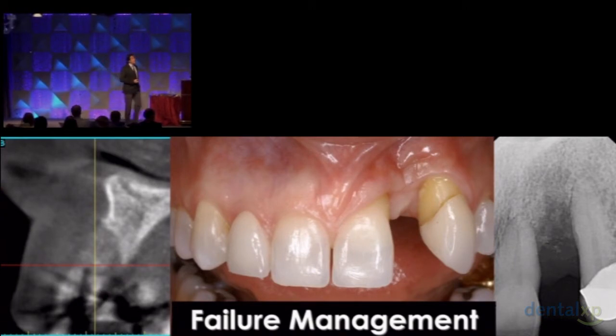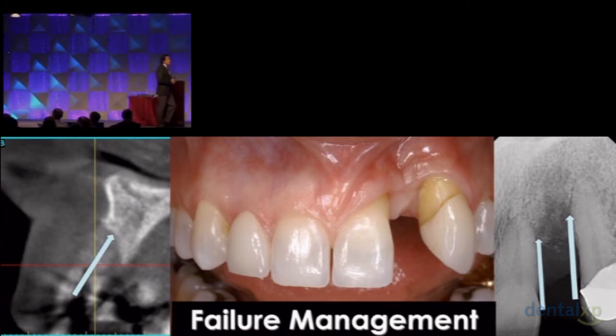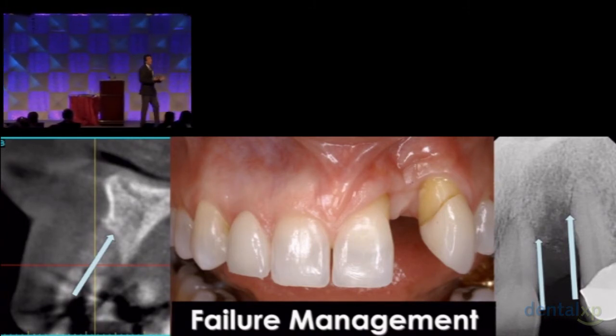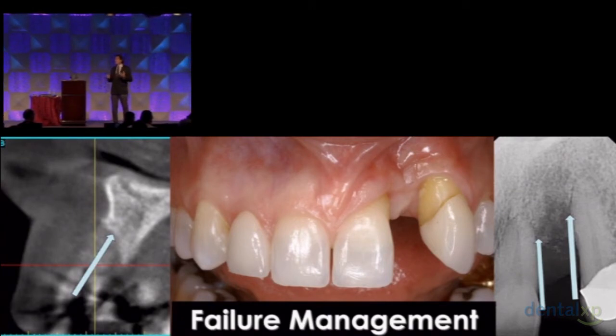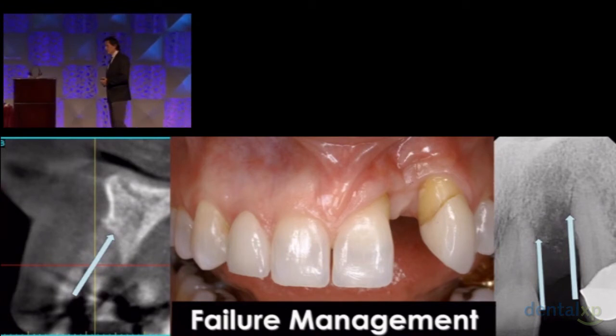The problem in this case was not only the loss of the bone around the implant site, was the subsequent bone loss on the adjacent natural teeth that are now extremely mobile, and the bone loss is significant. We're probing 12 to 15 millimeters from the contact point. Now you're looking at a patient who came in for a single tooth, who's now been told by 3 different doctors that the likelihood is that now she's going to be losing 3 teeth or having to replace 3 teeth.